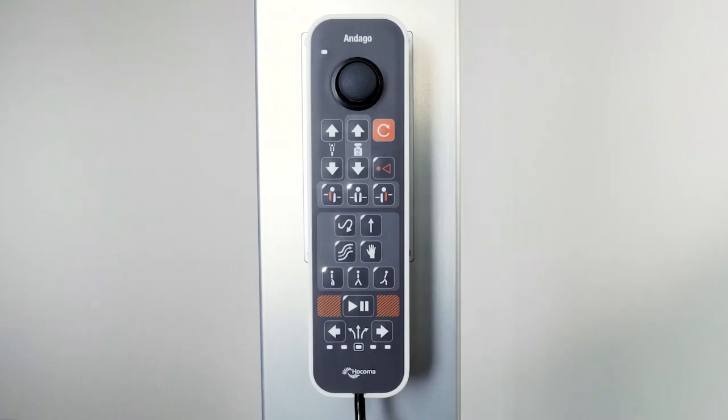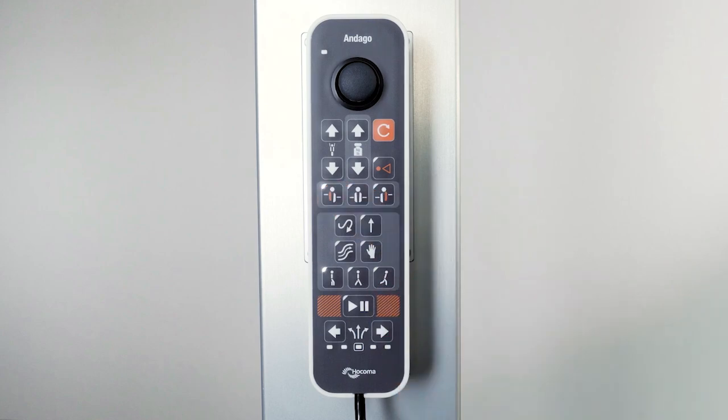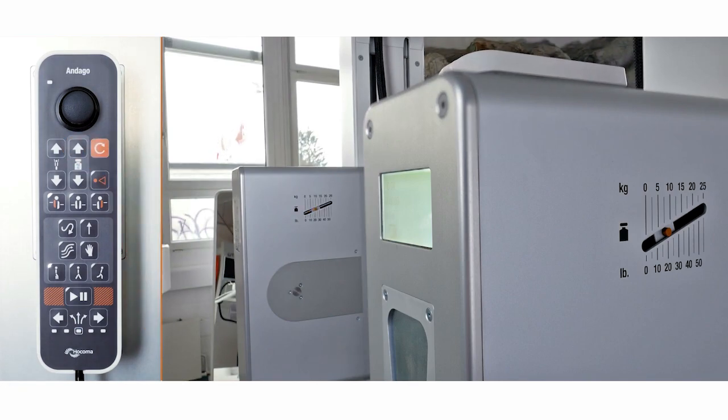In order to provide asymmetric body weight support, select the right or left body weight support button according to the side you want to unload and increase unloading to the desired level. Then repeat for the other side. With this option, you can adjust independent unloading values for the right and left side.